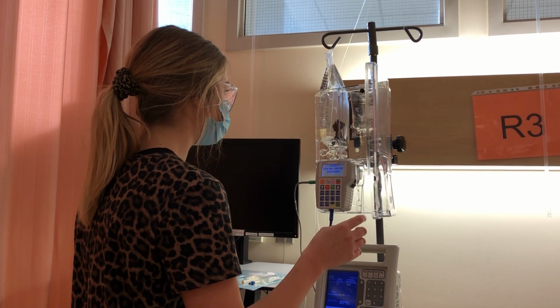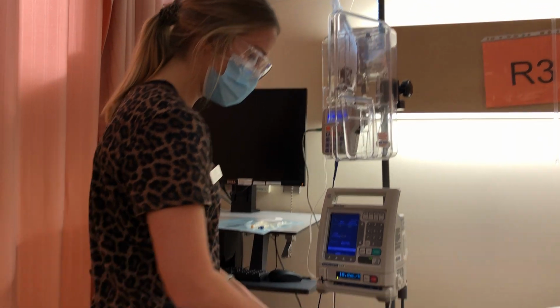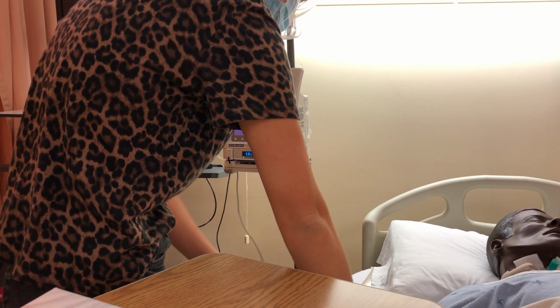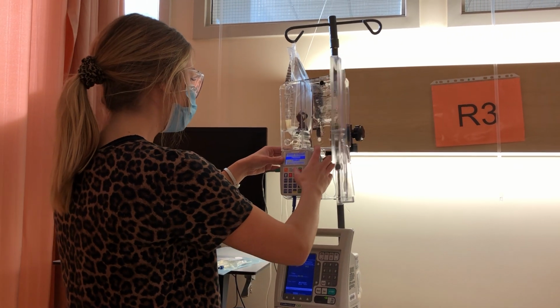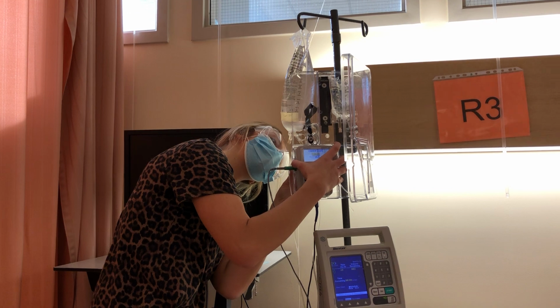I'm also noting that there is currently a carrier running right now. And it's all unclamped, and the site is doing well and good, accessible. So I want to program, yes. The code is in the back here. I have 94629.